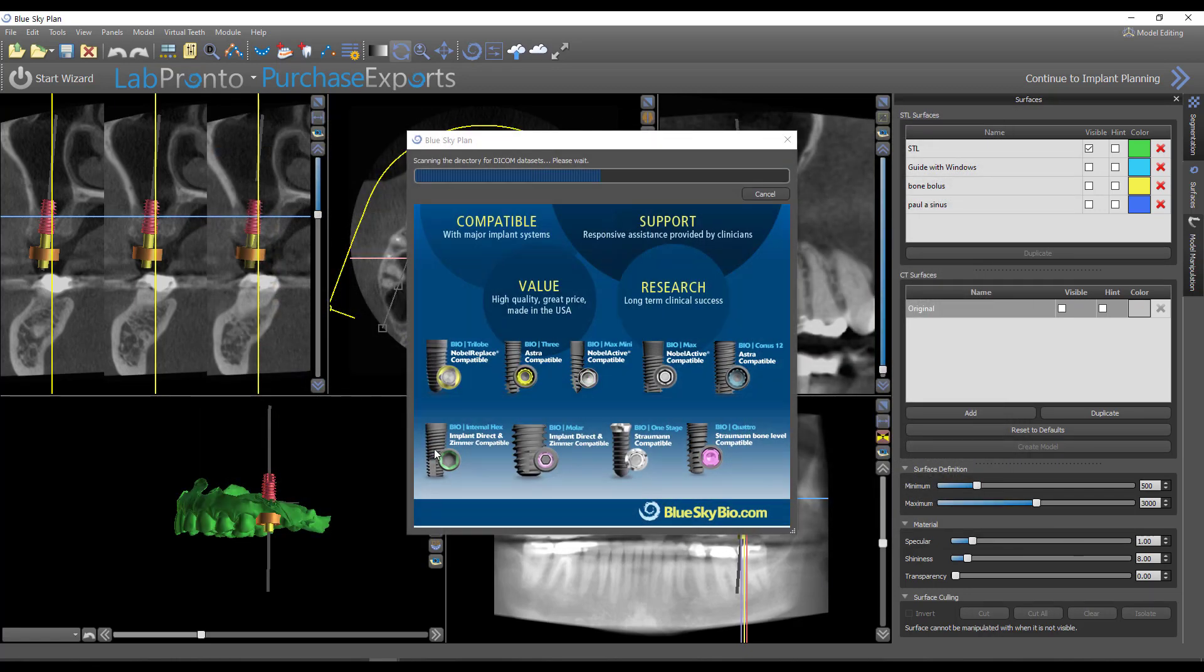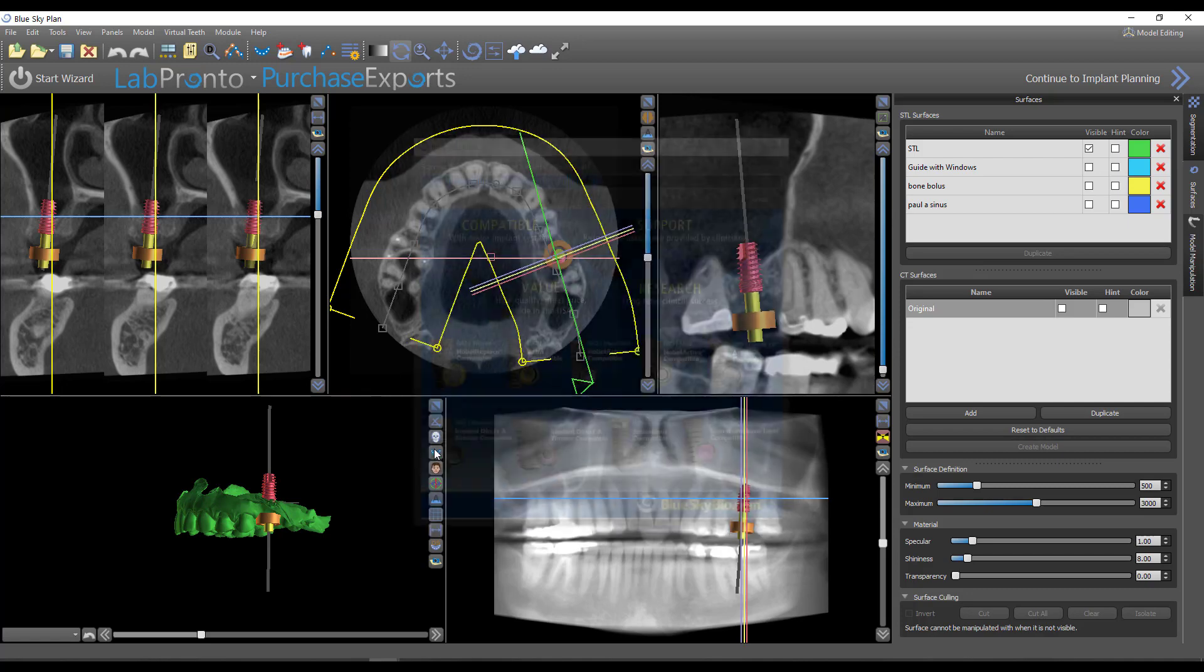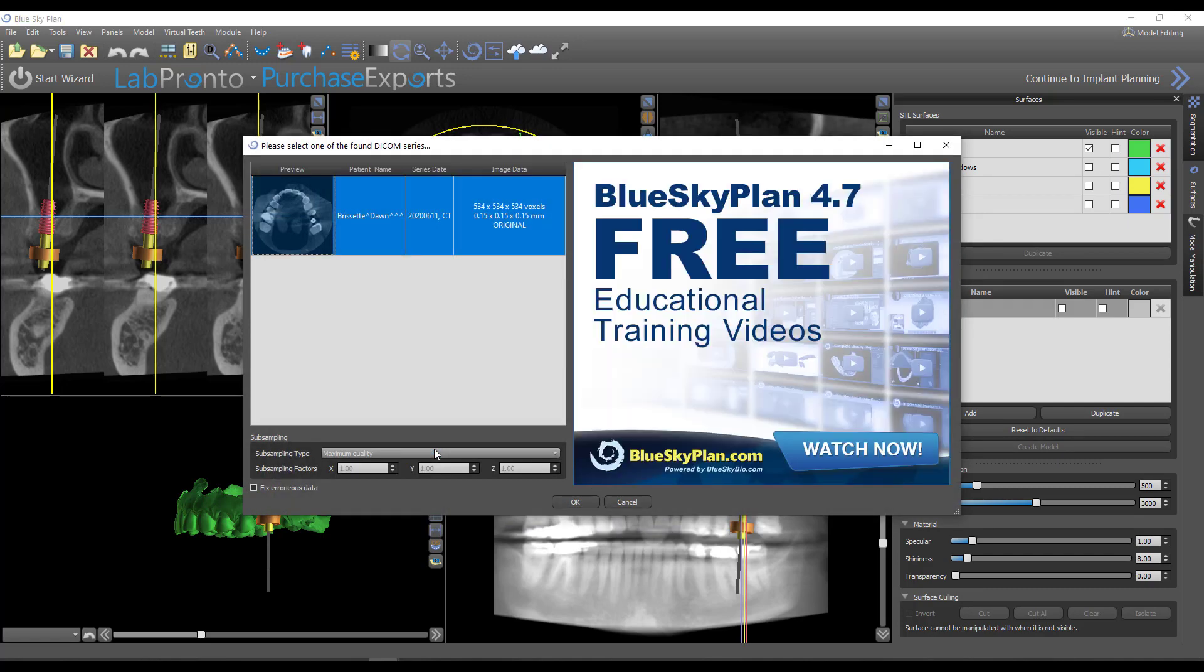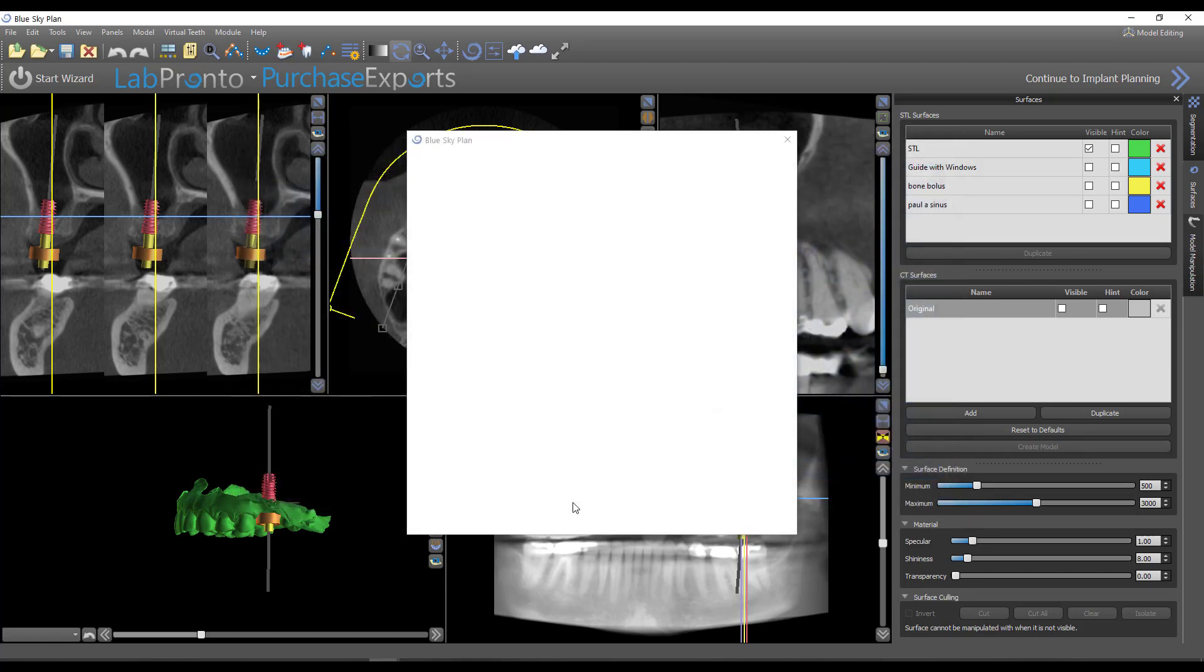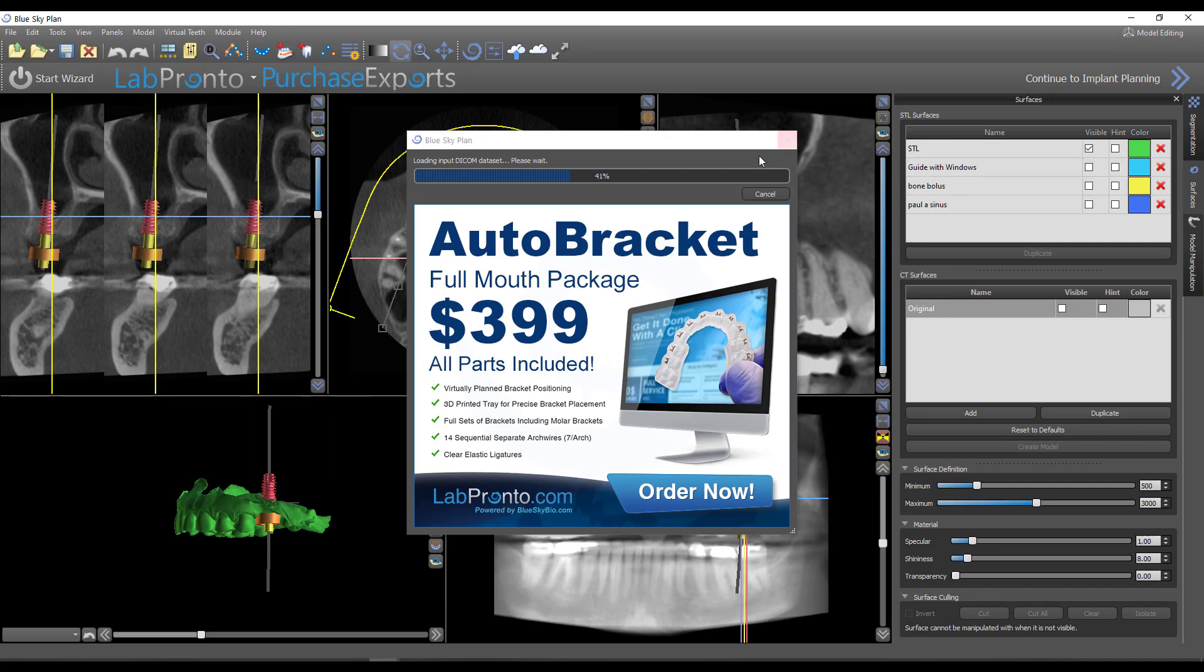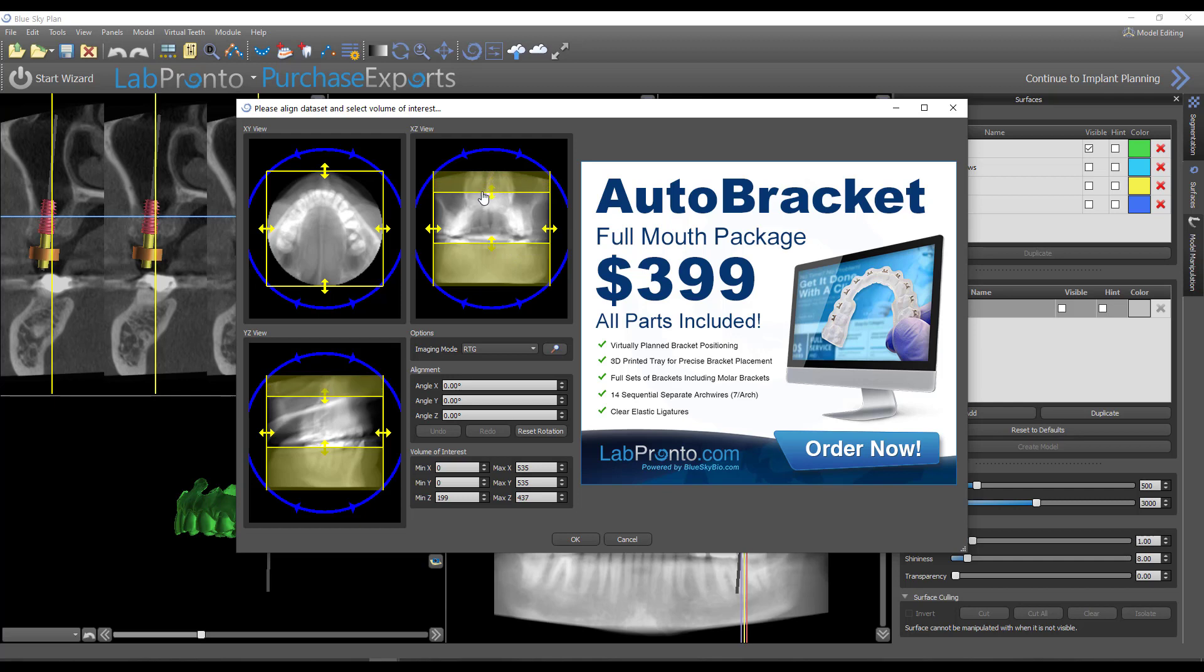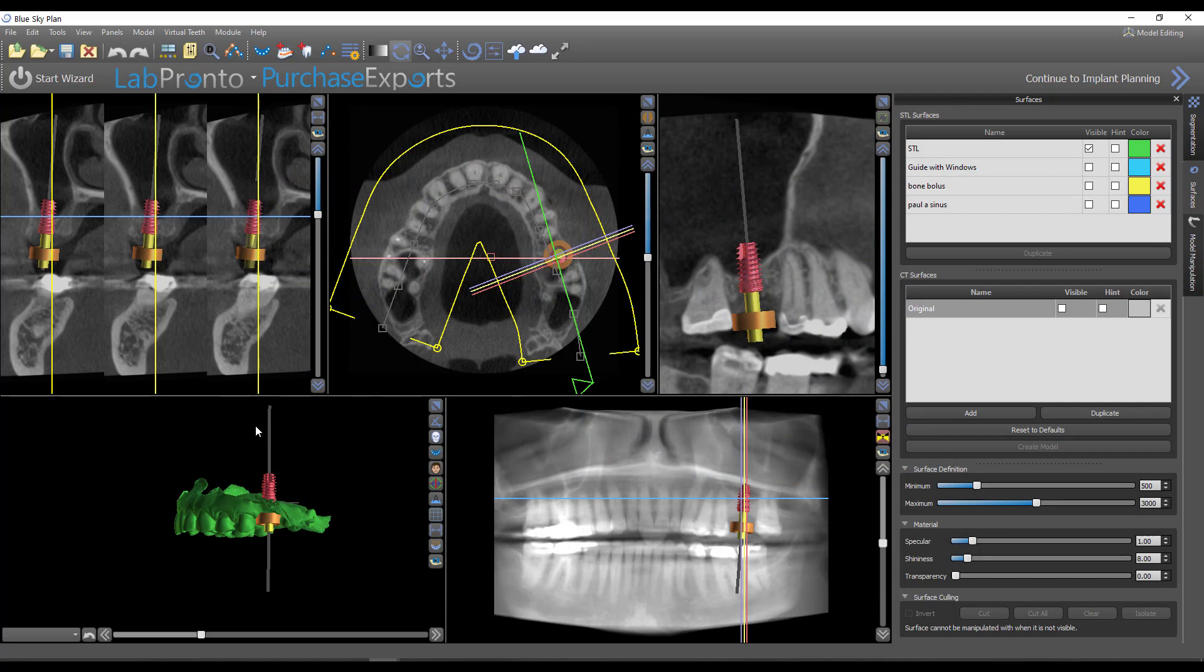And it's not as simple as just importing it and everything stitched. Remember, your patient positioning within the machine is going to be different. They might be open or closed more than one scan, so we're going to have to take a different approach. So I'm just clicking OK, and it's going to bring up the scan appliance window, which would typically be used if you've done a dual scan. You know, something like a denture with some radiographic markers on it, and you want to pull that in so you can see your implant positions. So we don't need a whole lot of this excess information. I'll get about halfway up the sinus, and I'm cutting most of the mandible off just to limit the field of view a bit, and I'll bring that in to about the teeth. So click OK once you've limited the field of view.